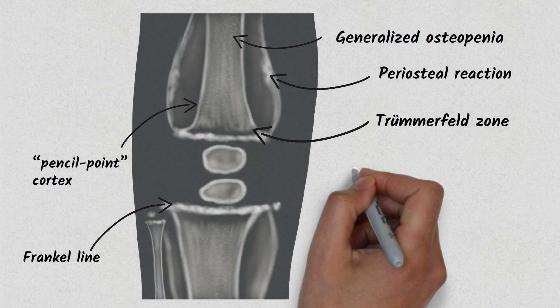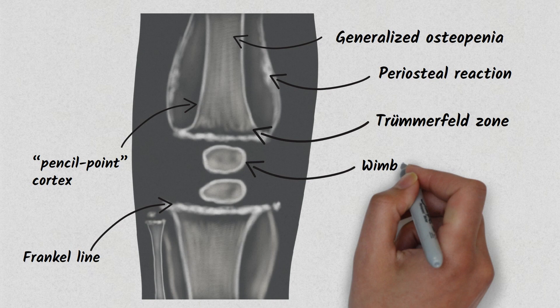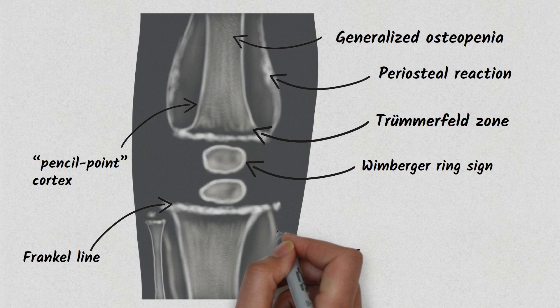Next, this circular opaque radiologic shadow surrounding the epiphyseal center of ossification is called Wimberger ring sign, which may result from bleeding. Here you can see radiopaque metaphyseal spurs that result in cupping of the metaphysis.